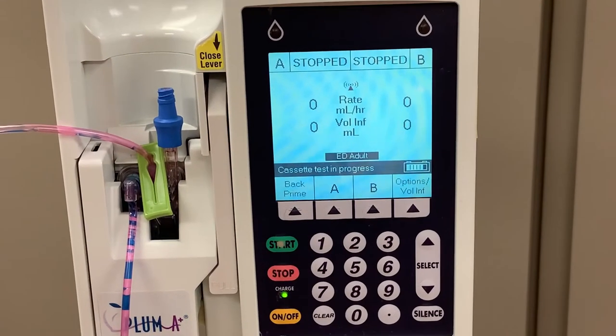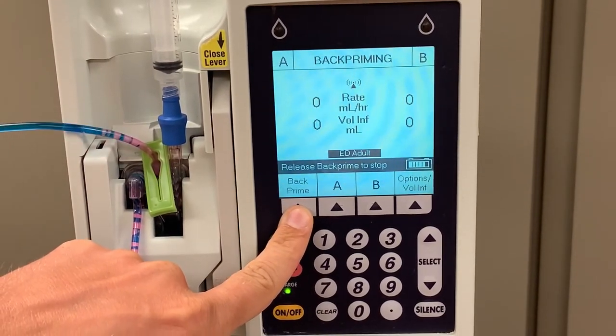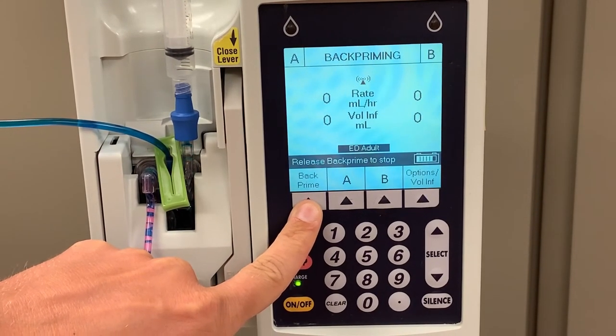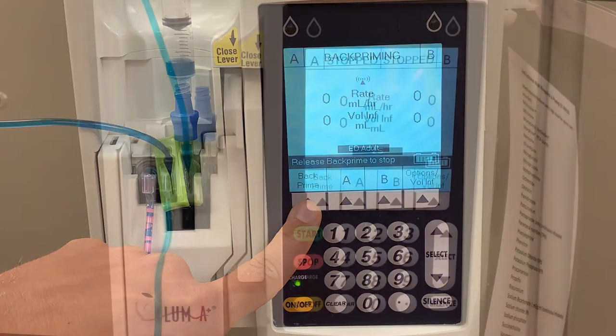If there are any bubbles in the line, the cassette test will fail and you will need to remove any air from that cassette. Take an empty syringe and screw it into the blue port on the top of the cassette. Hold down the back prime button. Medication will be pulled from the bag through the tubing and up into the syringe, along with any air that is sitting in the cassette. When all of the air is pulled into the syringe, release the back prime button and the pump will do a new cassette test.